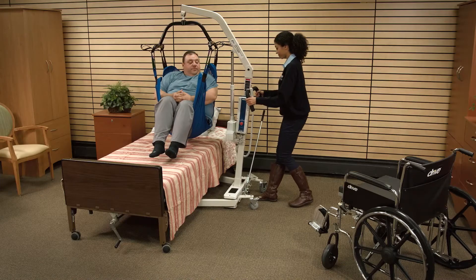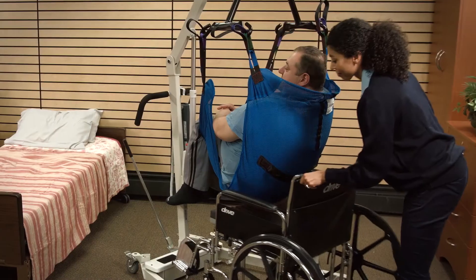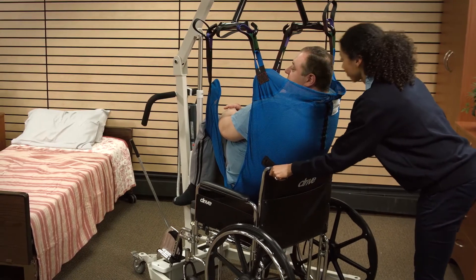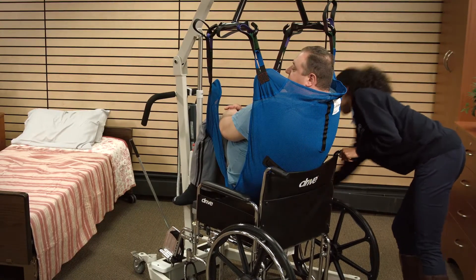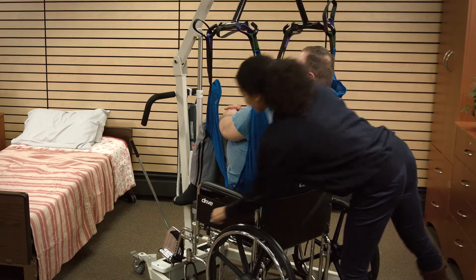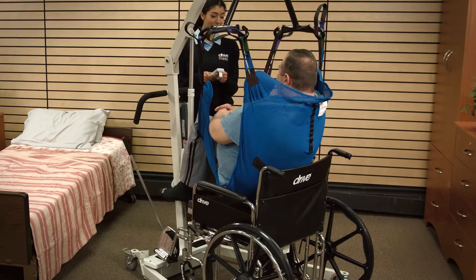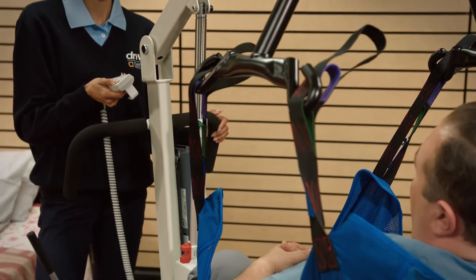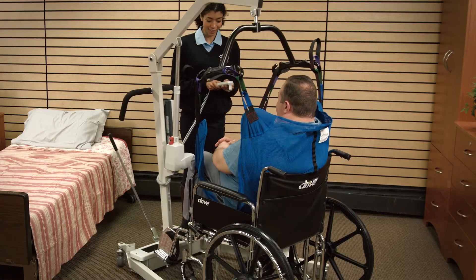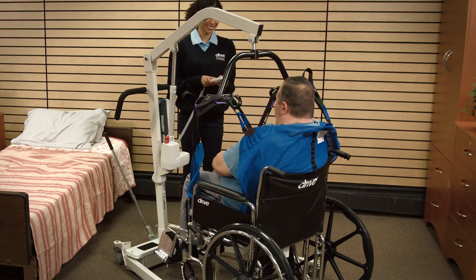Transfer the patient to the commode or wheelchair and position above the seat surface. Then lock the brakes of both the lifter and the commode or wheelchair. When the patient is seated, press the down button on the handset to gradually lower the patient. The patient can remain seated in the sling.